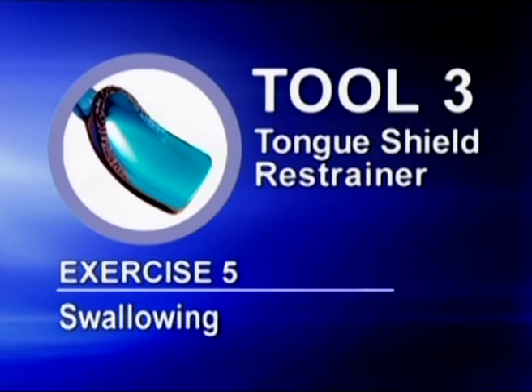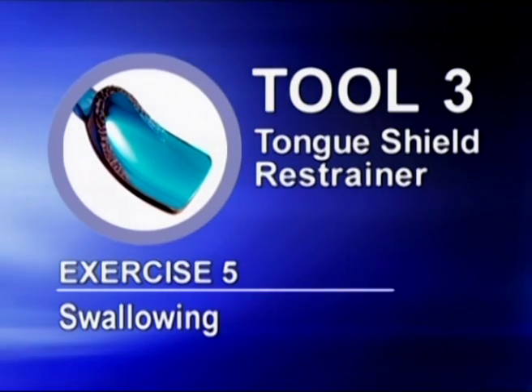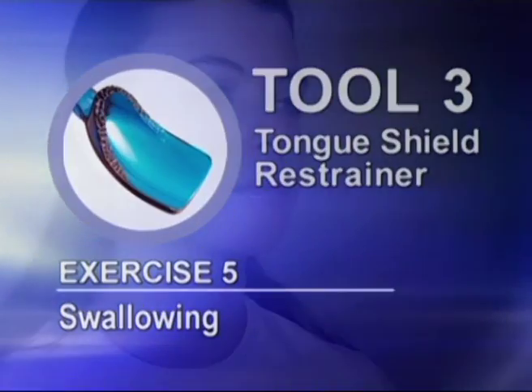The goal of Protocol 5 is accuracy of swallowing. Use water to moisten the mouth. Place tool number 3 on the palate behind the front teeth. Bite teeth on the handle, close lips, and swallow.